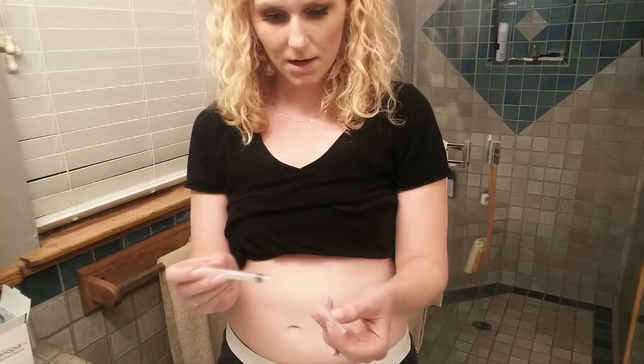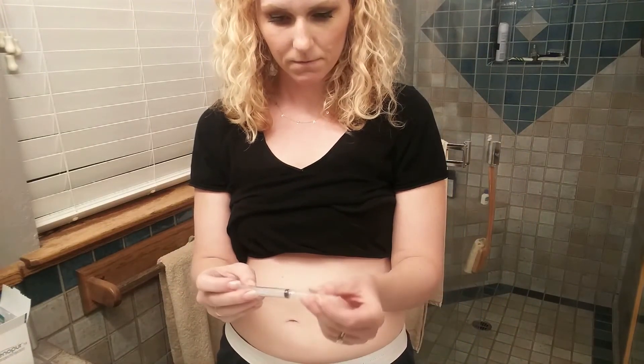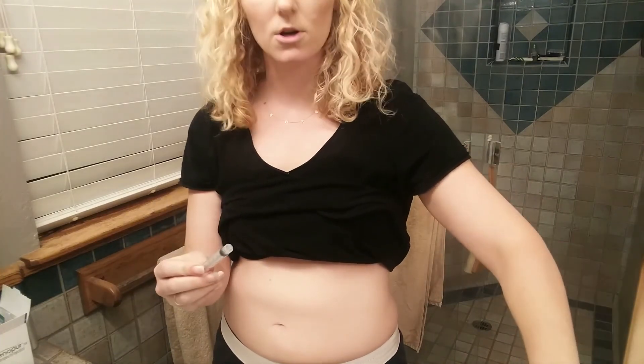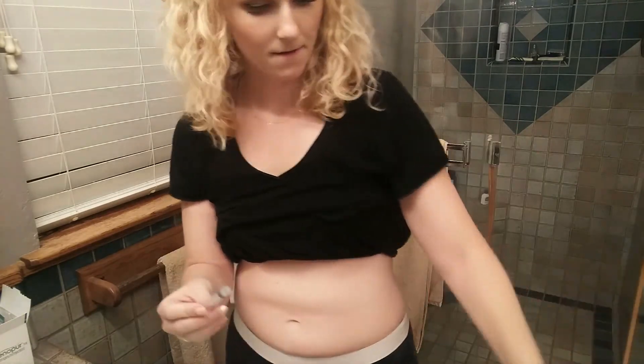Recap that needle, cap it, twist it, put it in your sharps container. And then just throw the syringe away. So next we will do the Gonal-f.